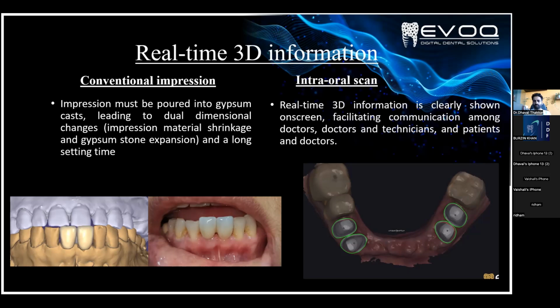Whereas in intraoral scan data, right now many companies are providing scan software where we can put the margin line into the scan software itself, and the doctor can detect the undercuts. The doctor can clinically check the occlusal clearance the same way in the scan software, and accordingly we can communicate with the lab. So the scanning software is also very smart these days, so that it can indicate everything before the patient is ready to go or the data is processed in the laboratory.